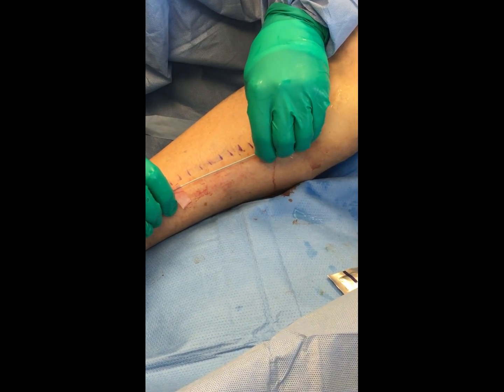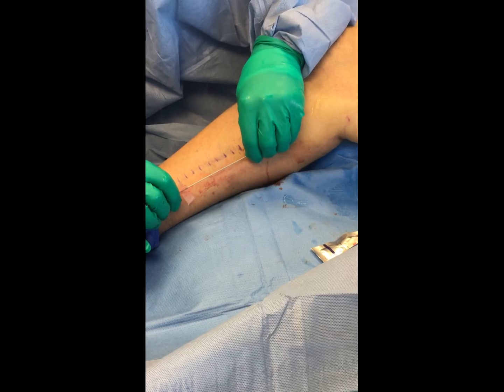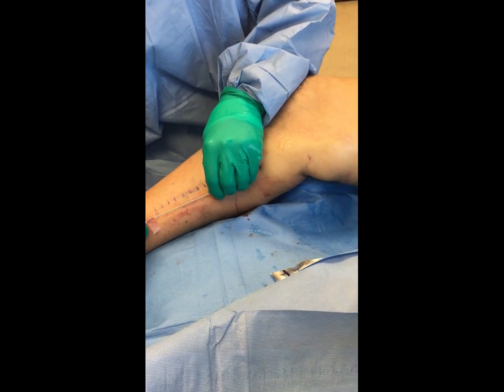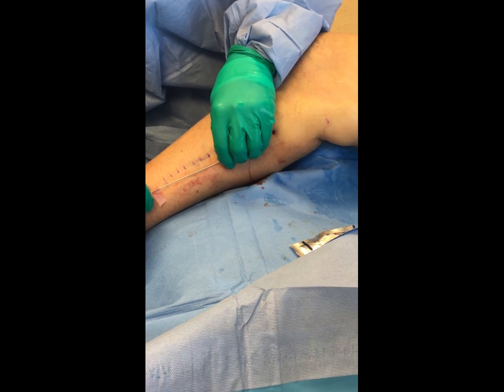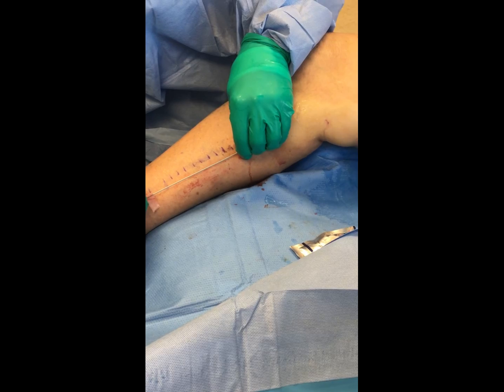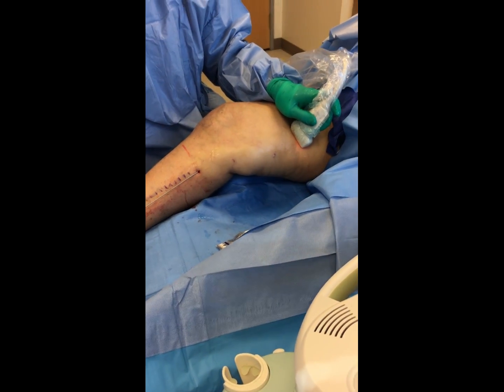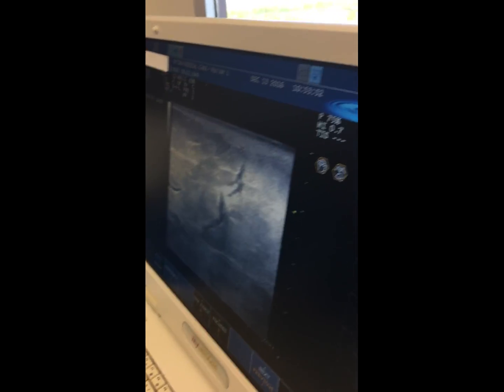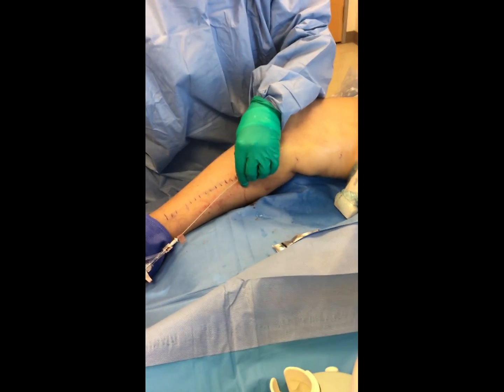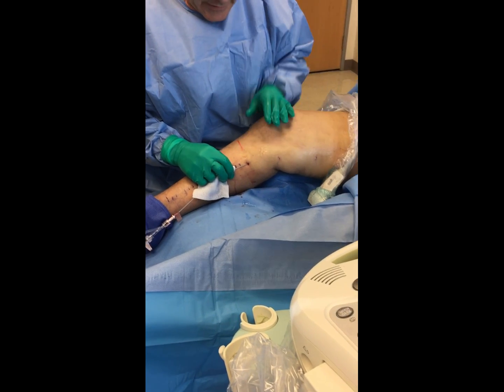What used to be basically a surgical procedure with general anesthesia — known as vein stripping — has now become literally a 20-minute in-office procedure requiring no general anesthesia, just local anesthesia. This patient's vein came out of the compartment — this is an anatomical variation. So this part, which is actually above the skin, I'm going to apply a much lower thermal energy; otherwise the patients will get a little bit of irritation.